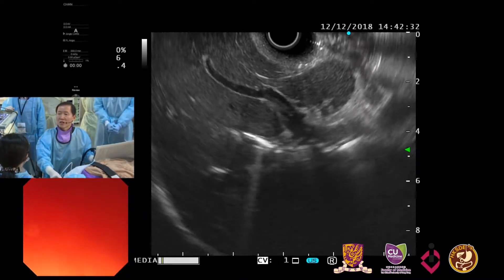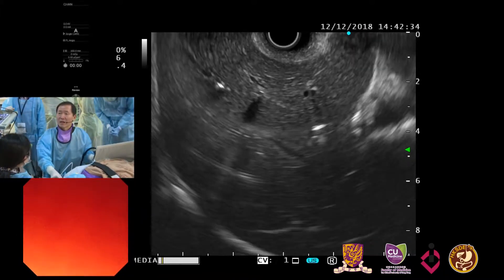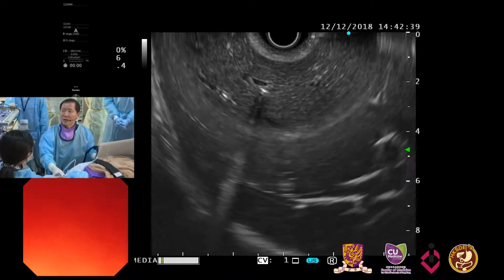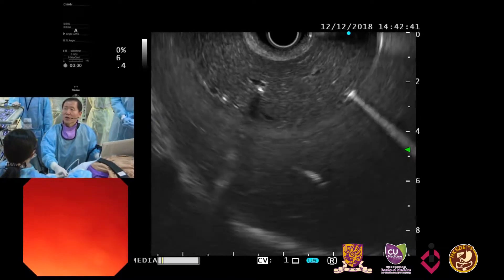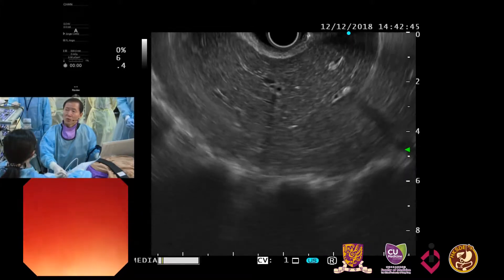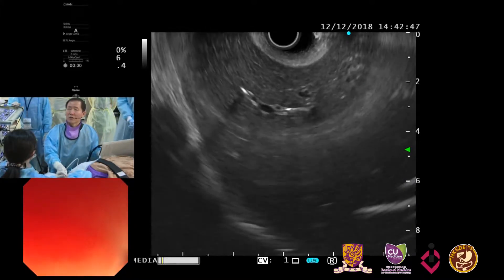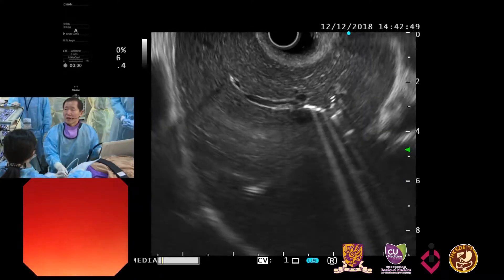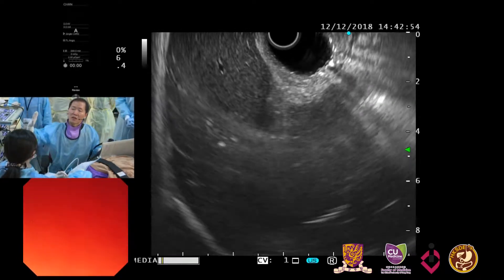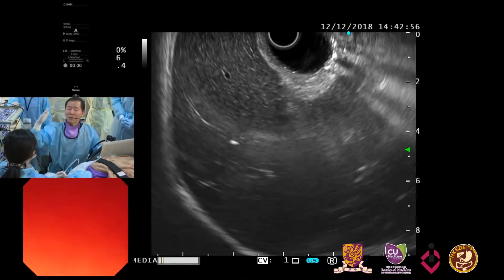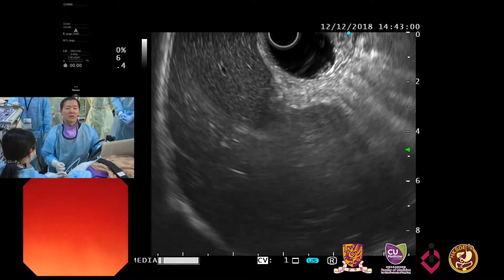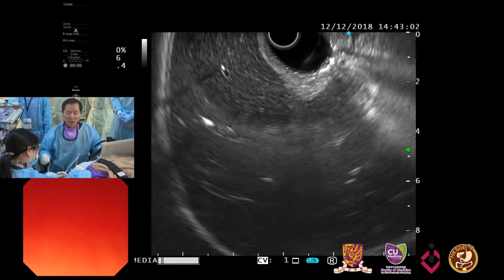Here we can see segment eight and segment five. We can also appreciate the right portal vein. This is the way we can evaluate most of the right side of the liver and get some orientation. This is the anterior segment, and in between we may see the right portal vein and right hepatic vein. The hepatic vein is generally on the margin of the liver segment, while the portal vein is in the center of the segment.